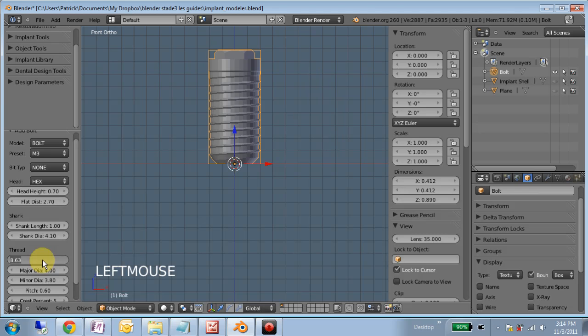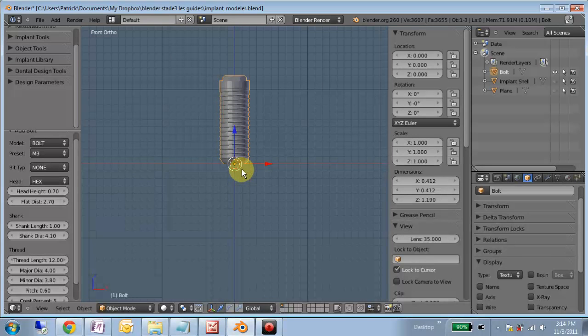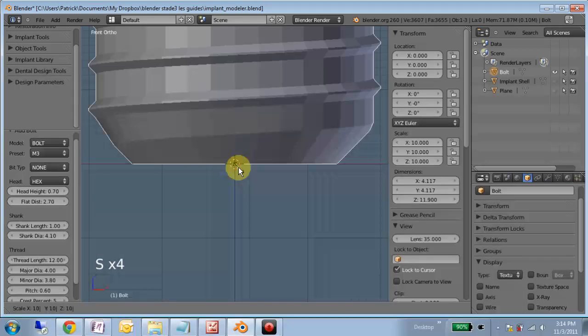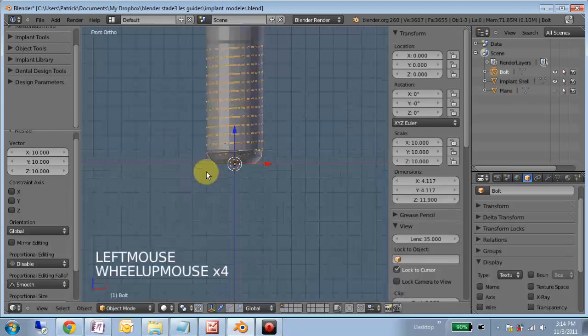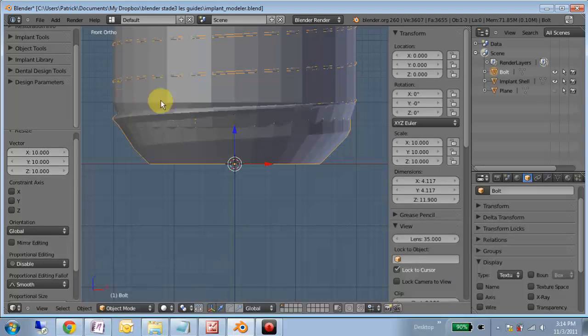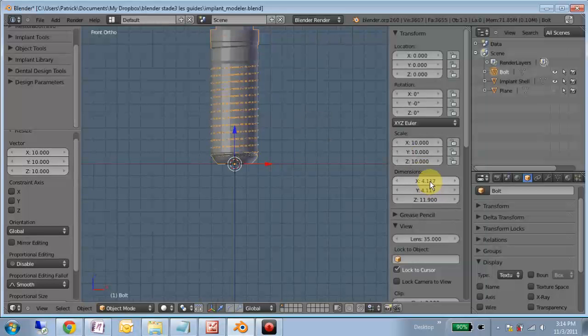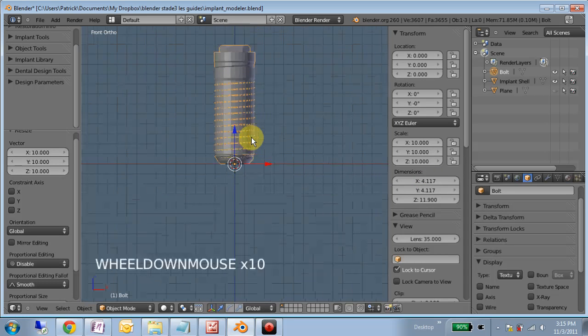So we'll make this 12 to give us ample threading here, and then we'll scale the whole thing up by 10. Zoom out when we look at our implant shell. We now see that the threads are right on the outer shell that we designed. If anything, it's a little too big, so we could scale that down ever so slightly, but we're at a 0.01, 0.02 difference when we round, so I'm not going to bother with that.